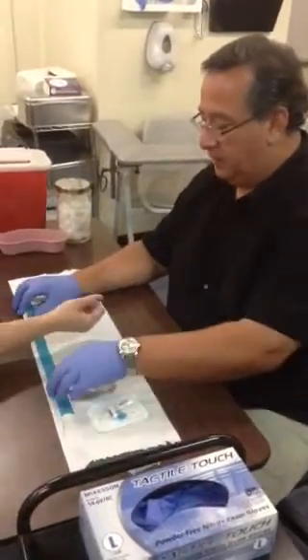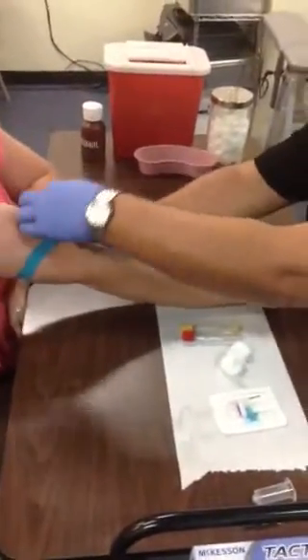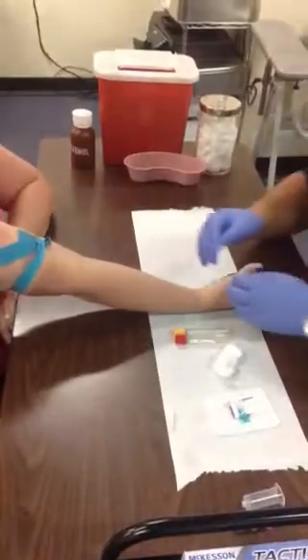The first thing I'm going to do is take a tourniquet and place it — remember — three to four inches above the puncture site. Butterflies can be used anywhere in the arm, not just in the back of the hand.